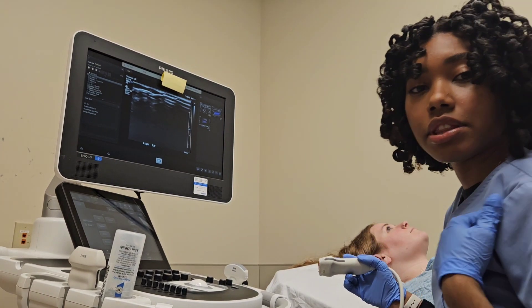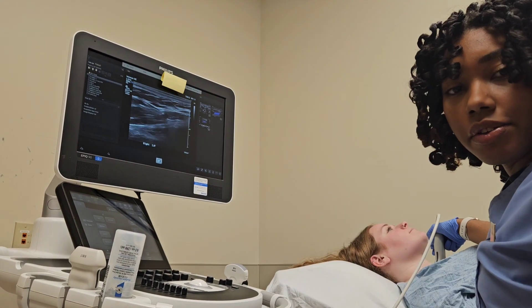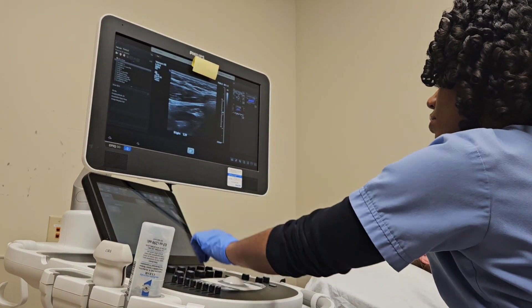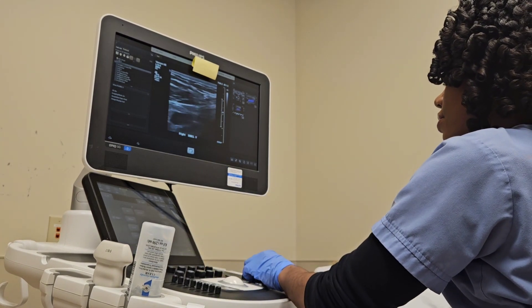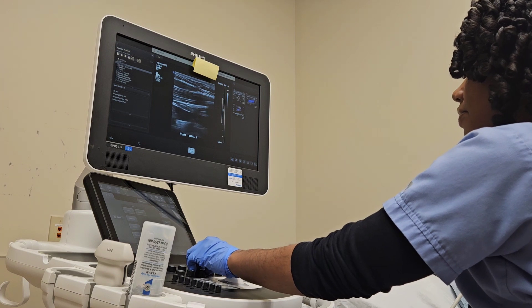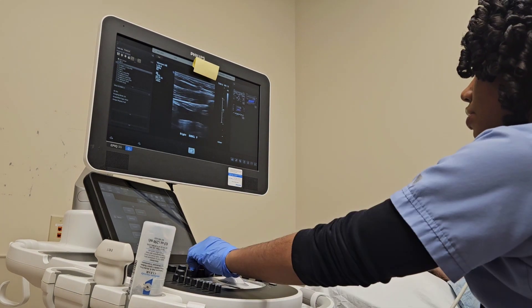Now we're going to move underneath the collarbone to the subclavian vein. Grab some gel and go right under the collarbone here. Make sure the label is right. I start in longitudinal for the subclavian vein — find the collarbone and angle downwards. Make sure you're not on the artery but on the vein, then stretch it out.